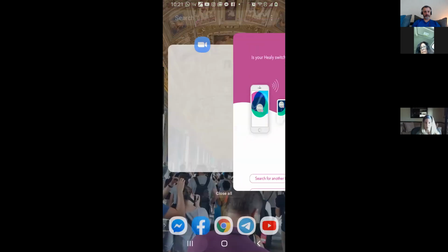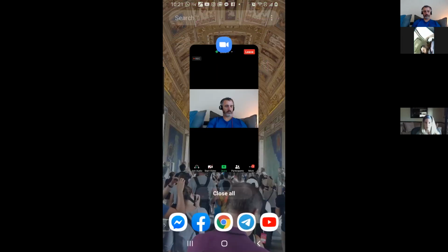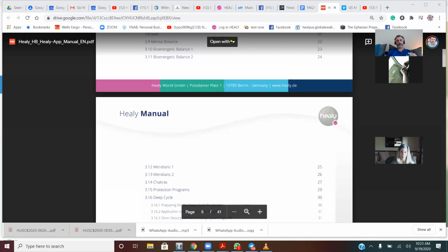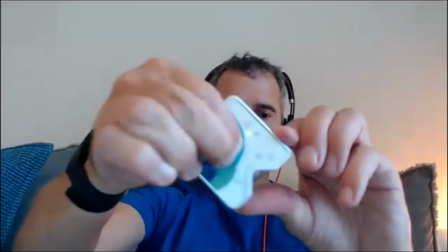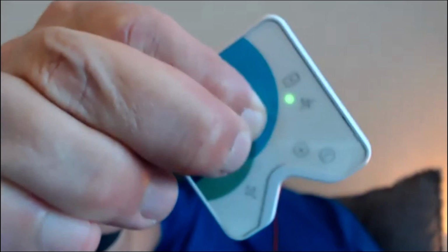And what I'm going to do right now is close that program, and I'll show you this a little closer. I'm going to press and hold this power button, and for a small device, you have to put a surprising amount of force on that power button. I'm going to hold it for 20 seconds until the light goes solid green like that, right?